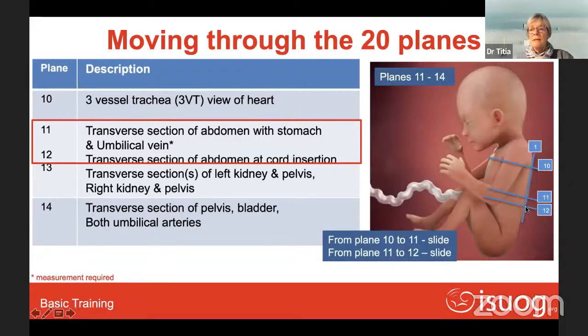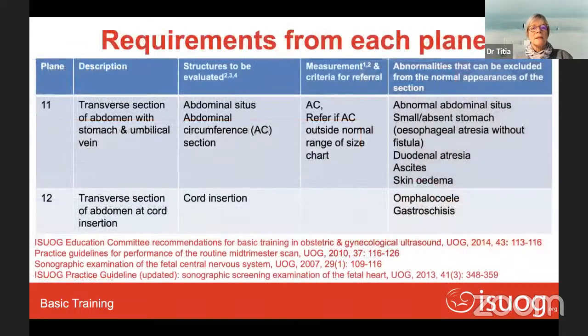But obviously, the baby will not lie still all the time, so you have to be a bit aware of how to adapt to the baby's position. It's not all that easy. But what are the requirements of this plane?